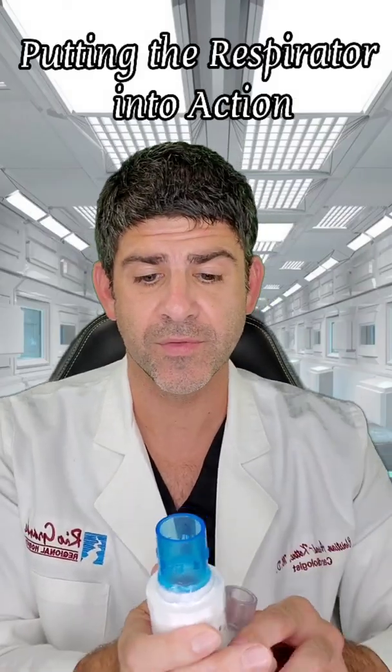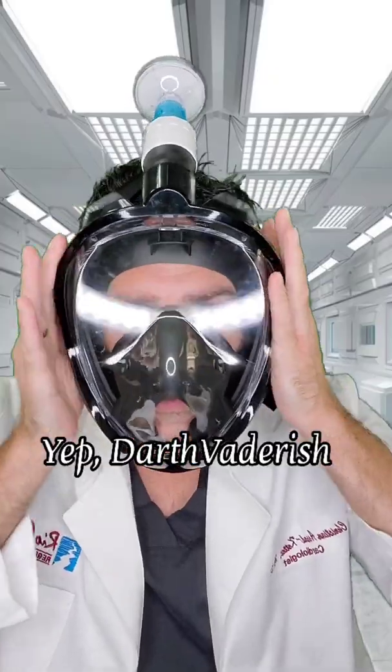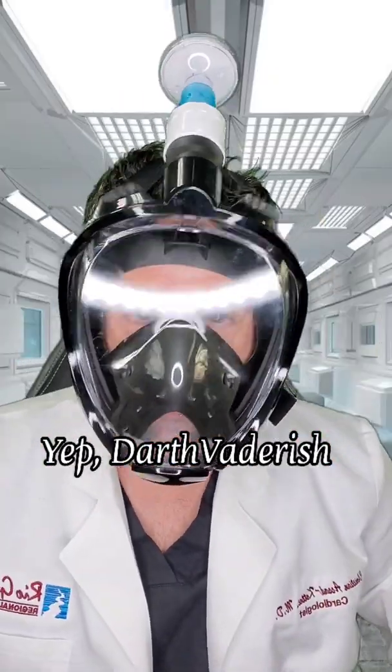Putting it into action: we've got version two, put the viral bacterial filter there — it doesn't even need duct tape — and you've got your own respirator.